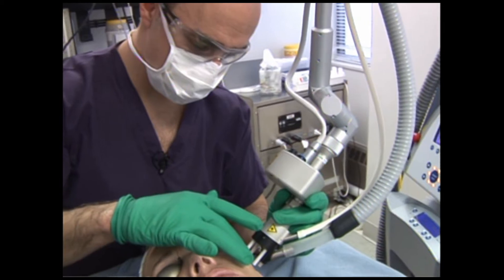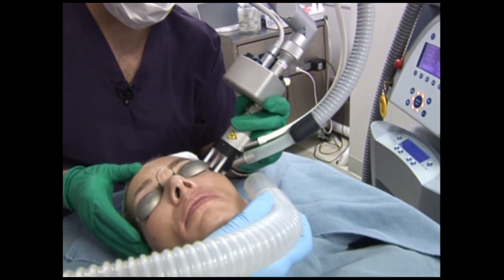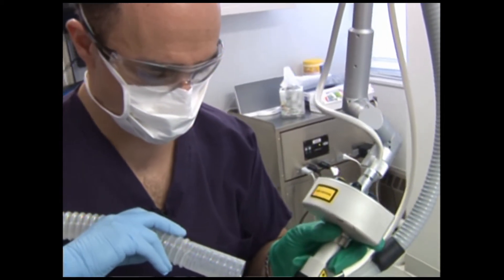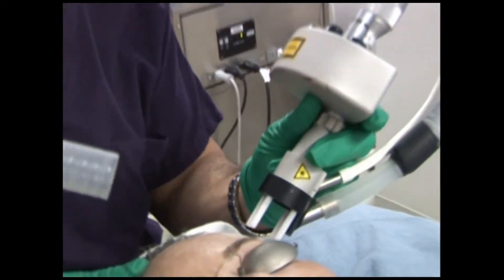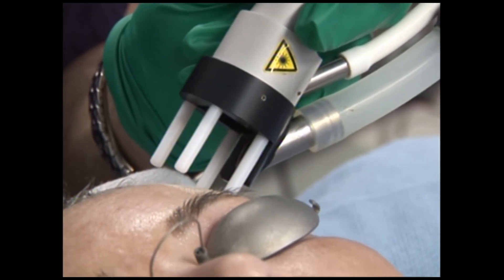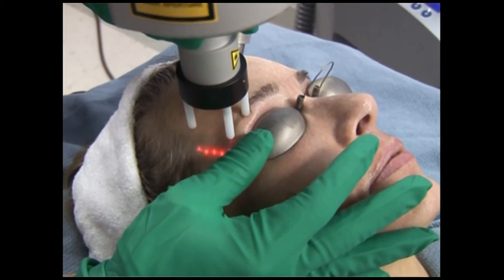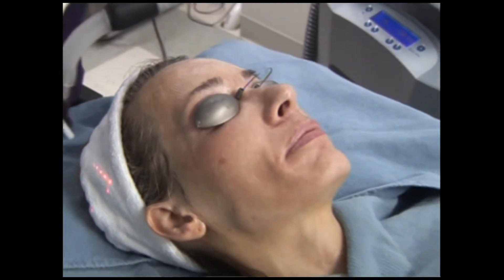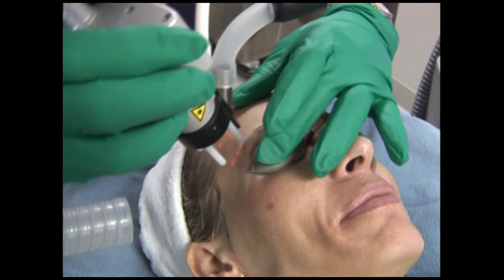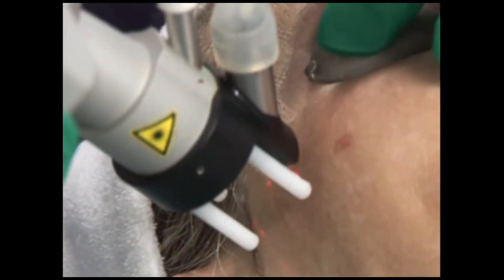Is that okay? Are you comfortable? It's really a pretty tolerable laser, and on these medium settings, patients really do very well. I notice the patient is actually smiling — that's a great sign — and talking to us.